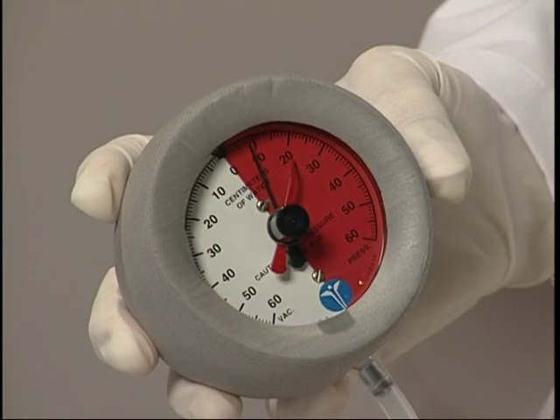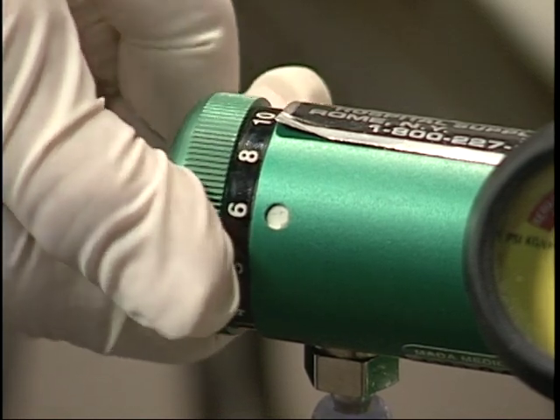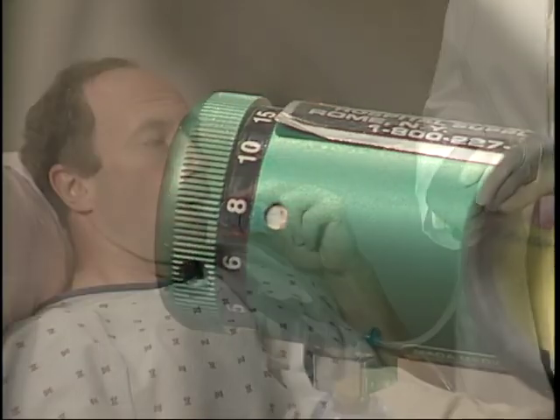If using a mask, apply the mask tightly but comfortably over the nose and mouth. While monitoring the airway pressure, slowly adjust the flow meter until the desired expiratory airway pressure is reached. Slow inhalations and exhalations by the patient will maintain adequate airway pressure during the breathing cycle.